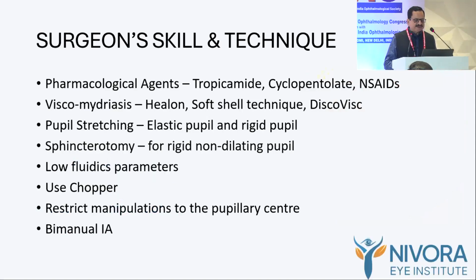Coming to surgical skills and technique, various pharmacological agents are used to dilate, like tropicamide, cyclopentolate, and NSAIDs. Then we can use viscomydriasis, with a healon, the soft shell technique, or the Disco-Visc. Then the pupil can be stretched, though it sometimes does not remain dilated.